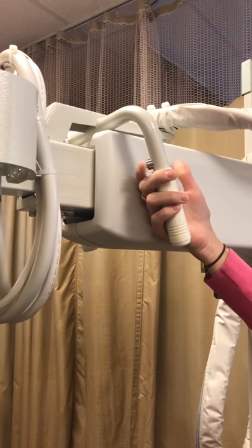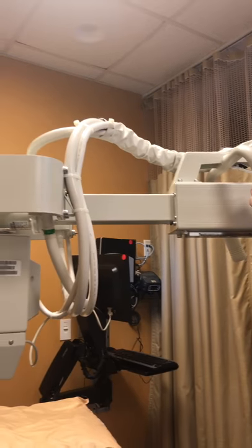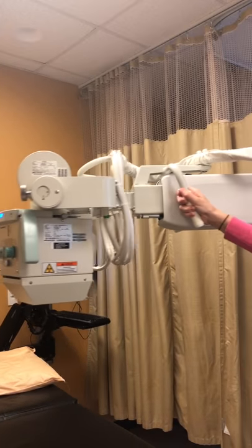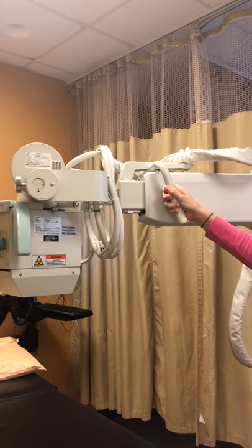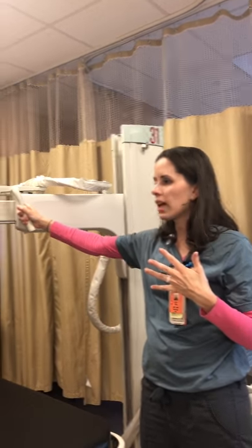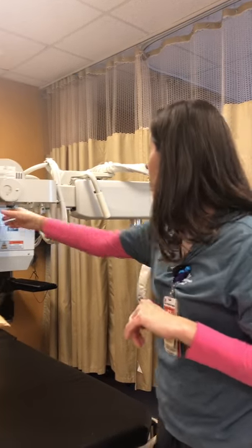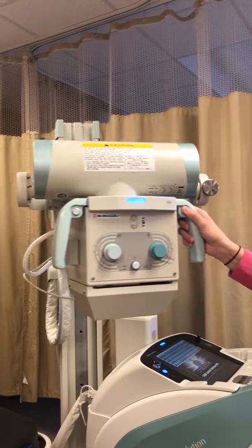You push this button on the inside and you're able to extend very easily — again slow and incremental. You actually have to drive this; it's not an automatic drive like you saw with the other buttons, but it is very handy if you can't get to the other side.